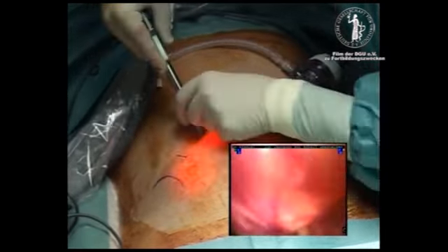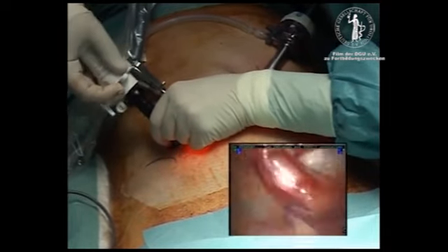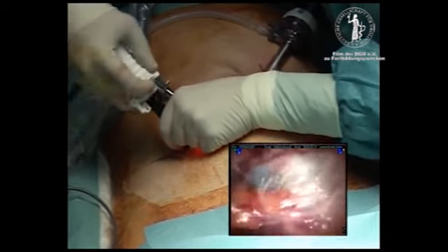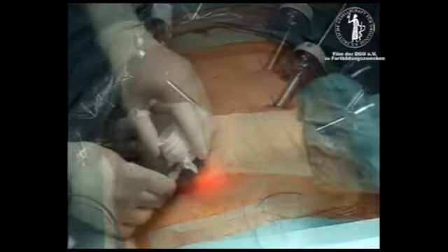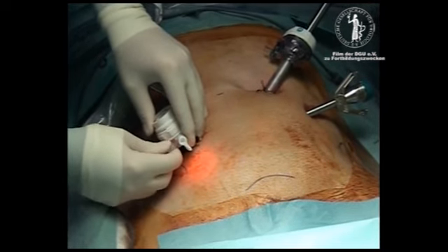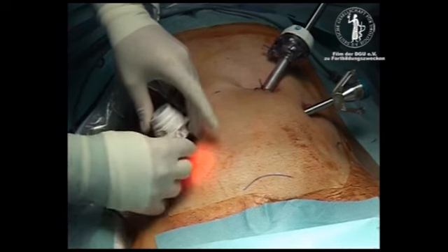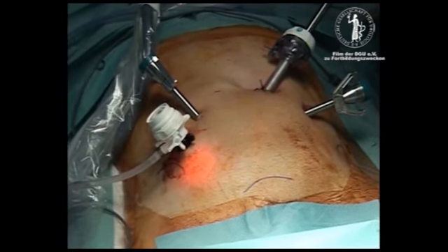The disposable 12 mm assistant trocar is placed just craniomedial of the right anterior iliac crest. The insufflation tubing is transferred to this port so that the cold CO2 is not in direct contact with the optic. This helps reduce fogging during the operation.